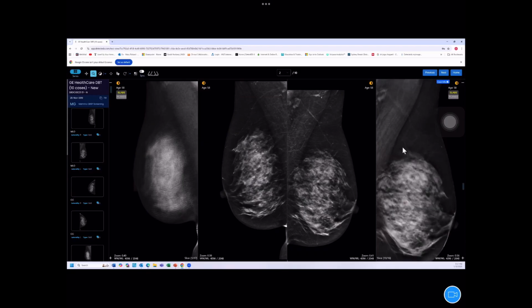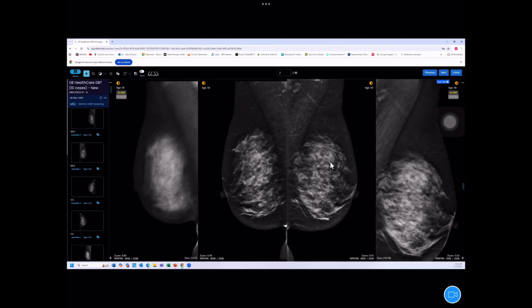So all of a sudden, the area is obvious, isn't it? Here's the cancer, little spiculated margins, small central density in here, very hard to perceive as an abnormality here on this 2D image, right? I just feel it'd be very hard to identify without quite significant careful scanning, whereas it's very easy to see here. Okay, this is another invasive carcinoma. We'll move on to the next case.